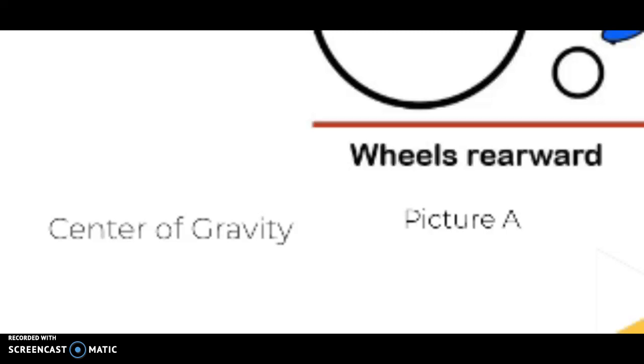Before we break down the wheelchair, the main thing to remember is the center of gravity. So the user's center of gravity affects the stability and the maneuverability of the wheelchair. In the picture, in the slide, this is the relationship that is shown.